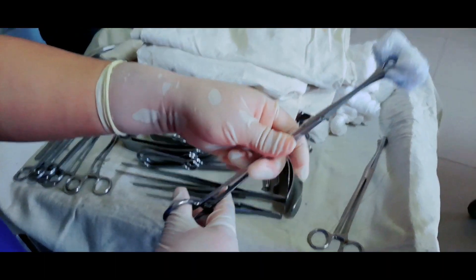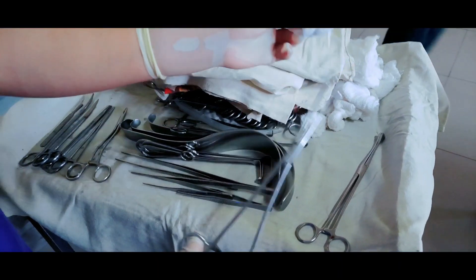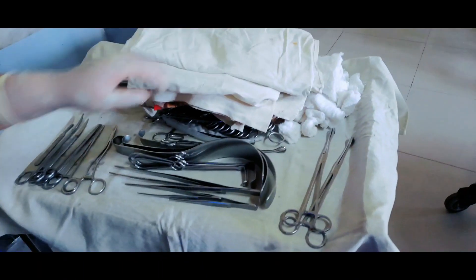Two sponge holding forceps, which are used to grab gauze pieces made into sponge, dipped in betadine solution, and used to clean the surface area before operation to prevent infection.